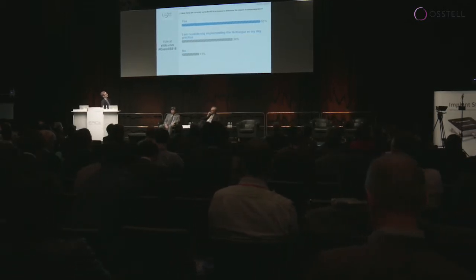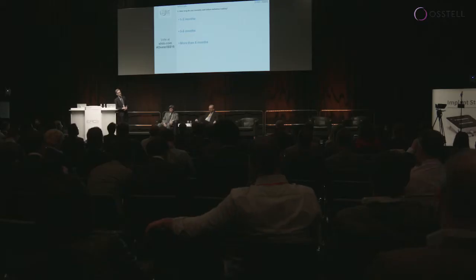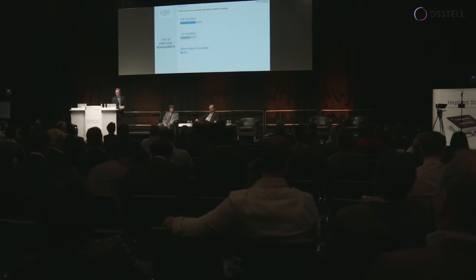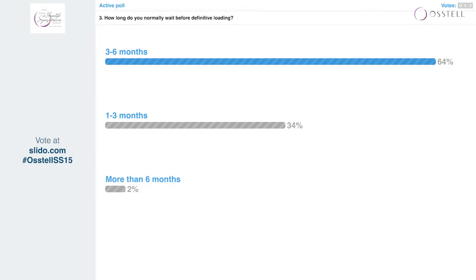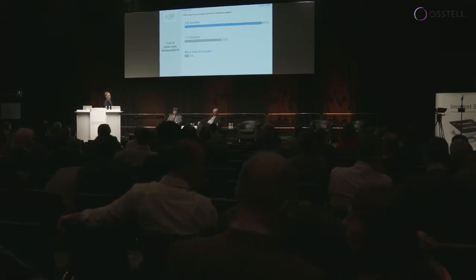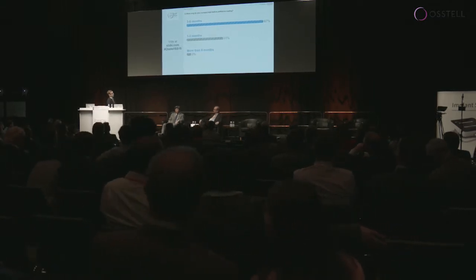So let's take the next one. This goes back to, I think, more or less what questions you had in Peter Moy's lecture. So normally, how long do you wait before you load your implants? 1 to 3 months, 3 to 6 months, or more than 6 months? Would you agree this touches upon the answers you had in your presentation? This was the most common answer, actually. 3 to 6 months seems to be the normal period of healing time that you apply when you use dental implants. So very few are saying more than 6 months.